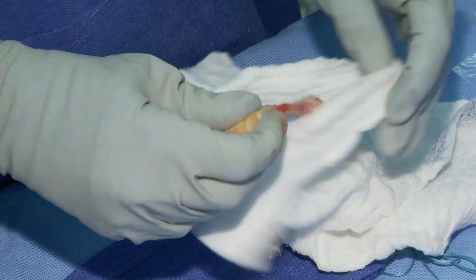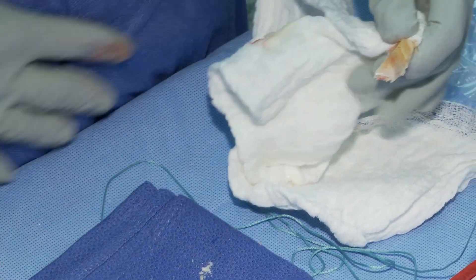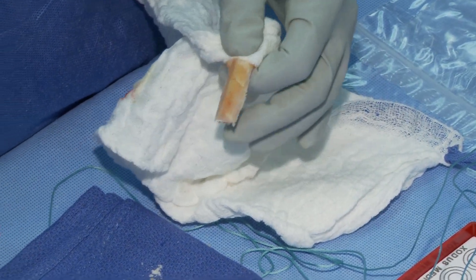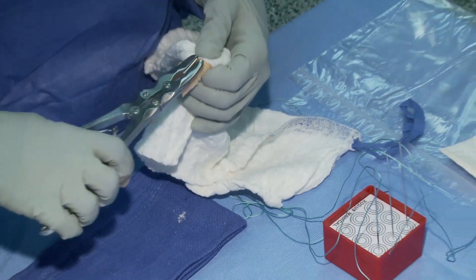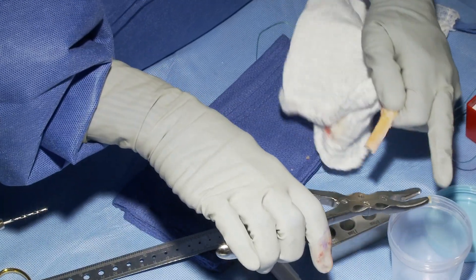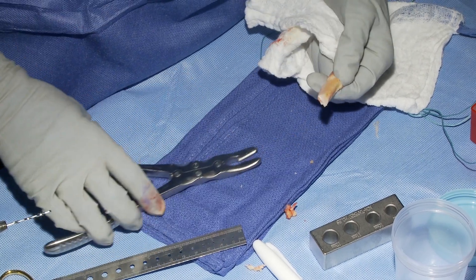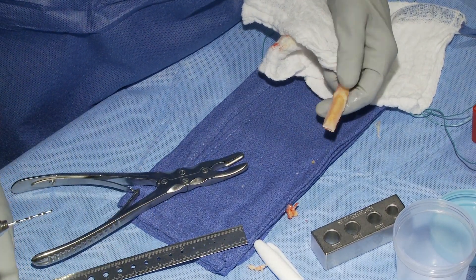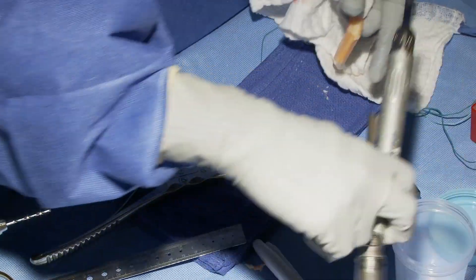Once you have the graft on the back table, you want to always have a firm grip on it. I start with the tibial side — first by laying it on the back table, beginning with the patellar bone plug which ends up going into the tibia. It's a little bit more triangular.